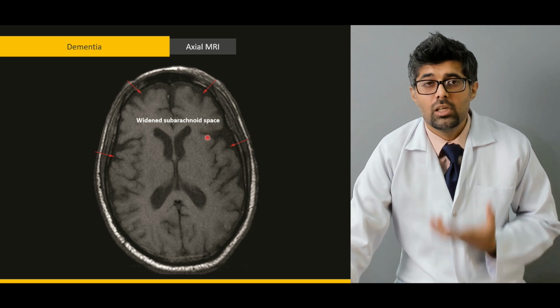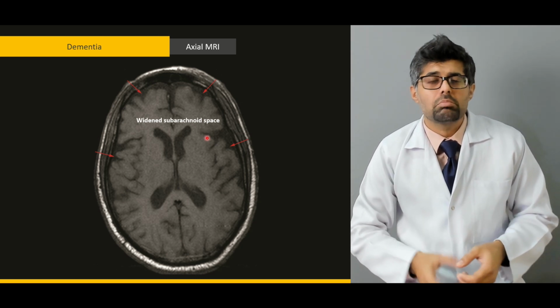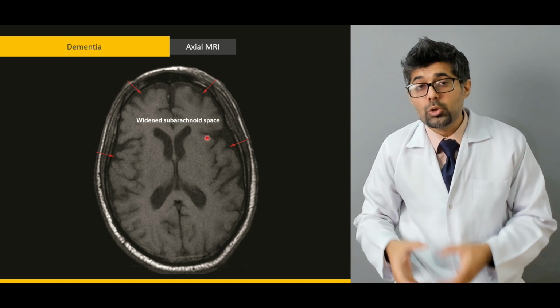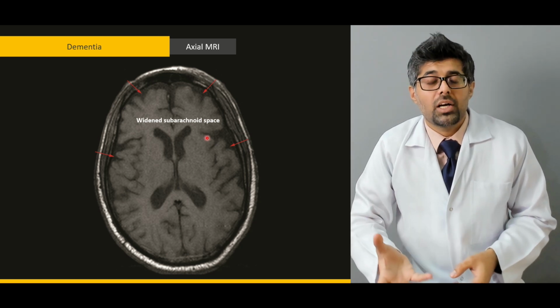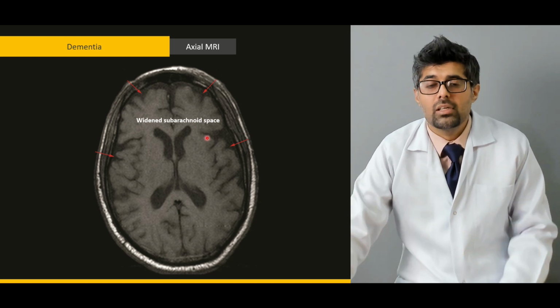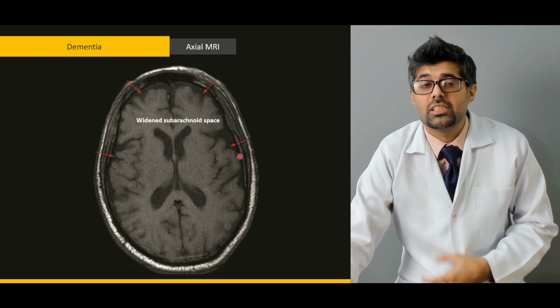Pick's disease. So, a patient with dementia, with symptomology of memory loss, of Alzheimer's disease, might not actually have Alzheimer's or dementia. He or she might even have Pick's disease. But in order to confirm that, if you have suspicion, or it might even arise as an incidentaloma, you are actually looking for signs and symptoms of Alzheimer's disease, where you actually find Pick's disease here. So this one is very important because again the symptomologies match.